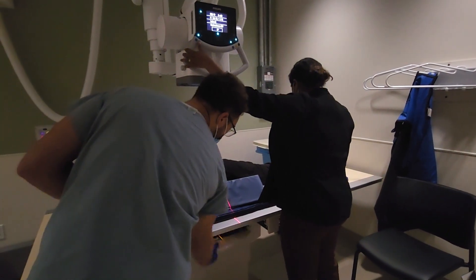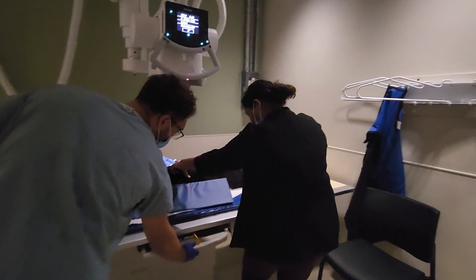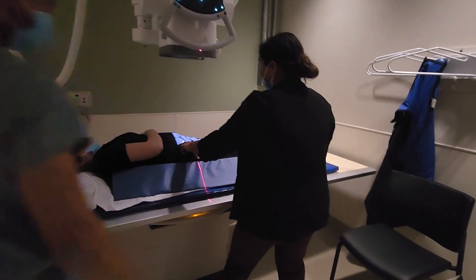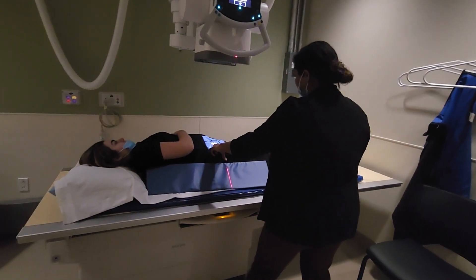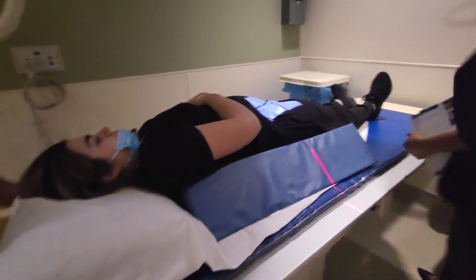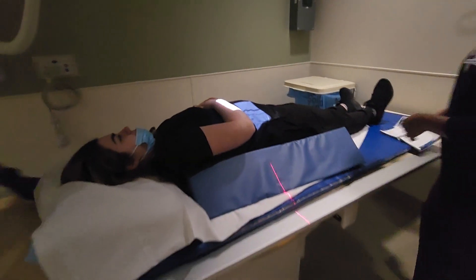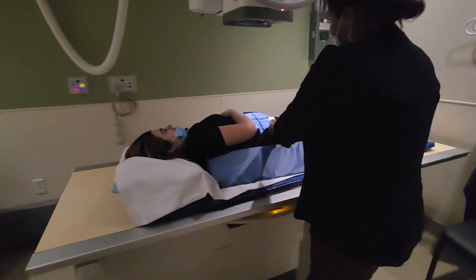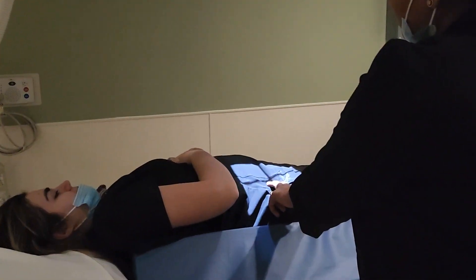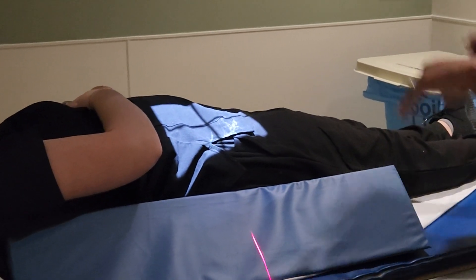The center for this is one inch medial to your elevated ASIS. Could you scoot down a little bit? So from the ASIS, we're going to go one inch medial. Collimation is six by ten. And on the lumbar, we said we're looking at the side closest to the IR — correct. For the SI, it is the side that's up.